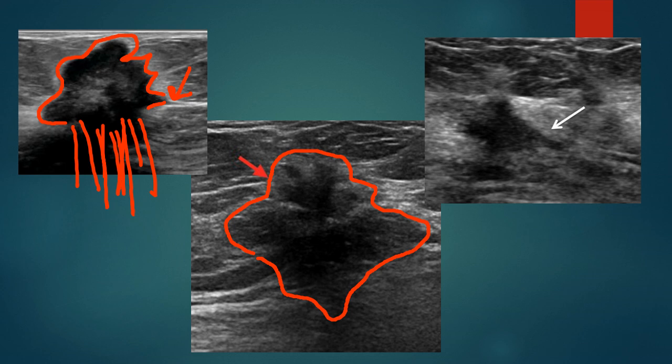And this may catch your eye, but you may be wondering what the border is, and it's this whole area. So again, very irregular in shape and how they're behaving, very hard for us to pick out right when we're first starting to scan.